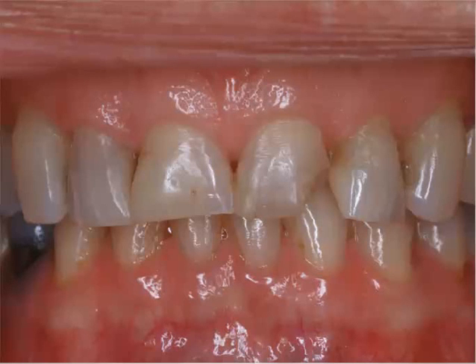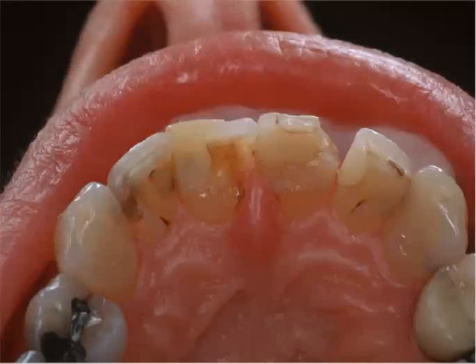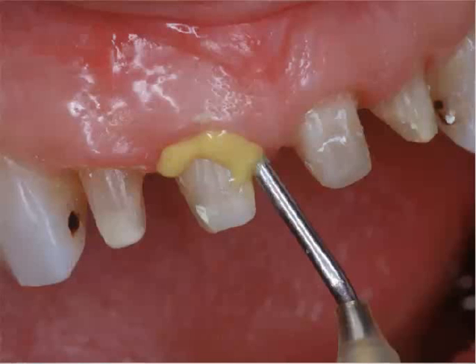In this type of case, we're going to make some final CAD/CAM restorations for this patient. She's a middle-aged lady who had extensive composite work done. I had done some pin-retained composites for breakdown. Certainly the need with this type of situation is to place all-ceramic crowns. So as we survey this case, we have to think about, after we're done with the preparation, how best we can deliver the material, especially the light body.